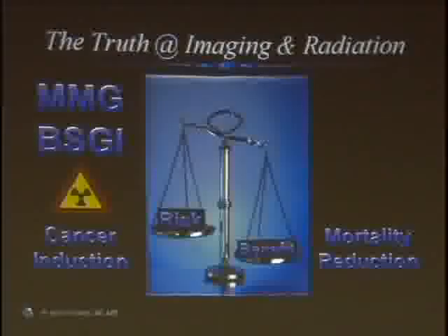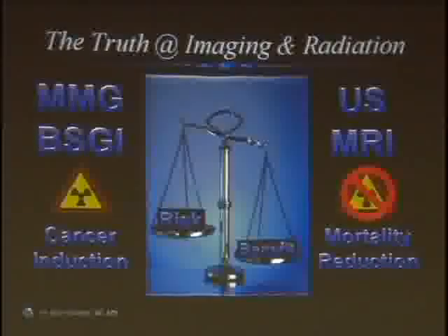There are 2 modalities that we talked about that do not use radiation. Those are ultrasound and MRI. But again, I told you they are not a replacement for mammography, even though they have no radiation, because there is no statistical data at all, and there probably never will be, because of the enormity of the studies that would be required, to prove that these change mortality like a mammogram does.